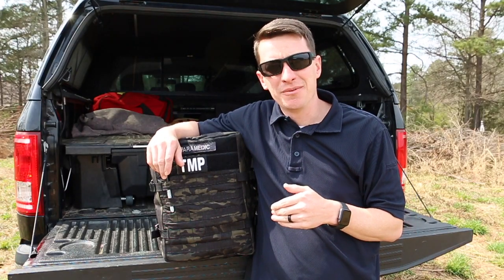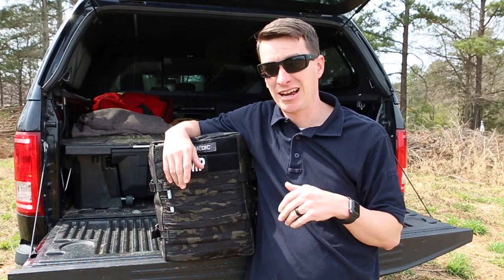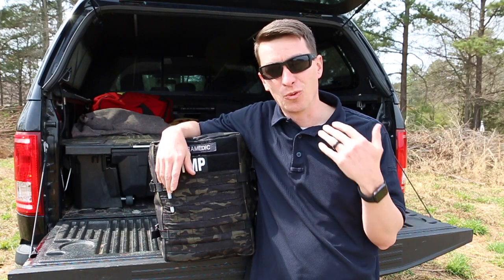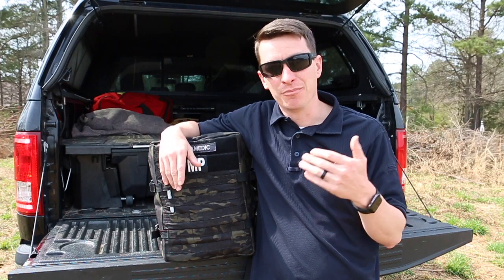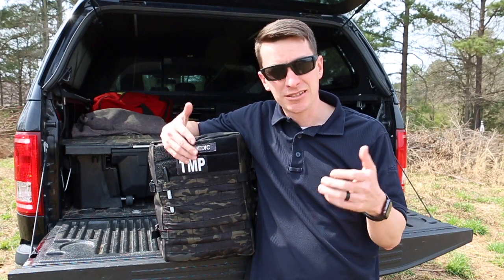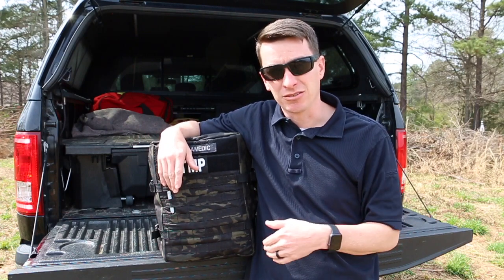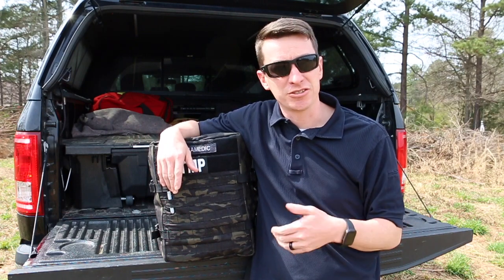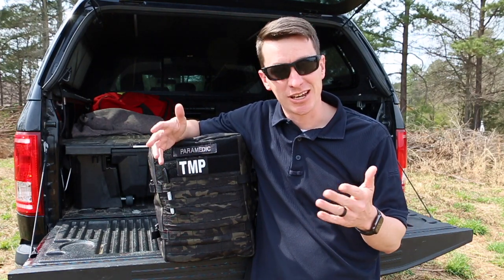Welcome to another video from Skinny Medics. In this video, I'm going to be taking a look at the SOE Medical Backpack, and you guys have been asking for a review on this one for a while now. So besides running Medical Gear Outfitters and making YouTube videos, I still am in EMS part-time, but I am one of the paramedics on a SWAT team. I'm also one of the paramedics on the search and rescue team, so I get to use my stuff out in the field.